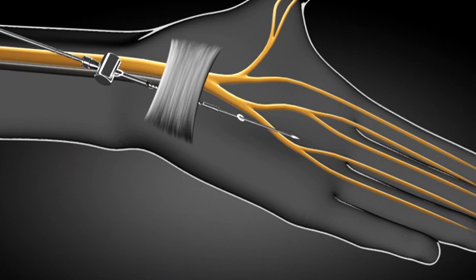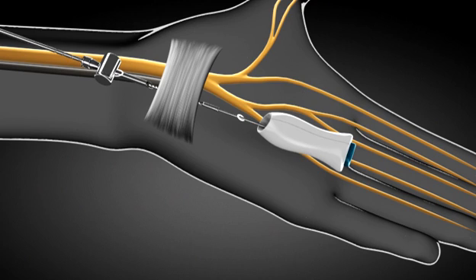The distal handle is then attached by pressing the thumb button and guiding the carpal tunnel release blade tip into the handle.